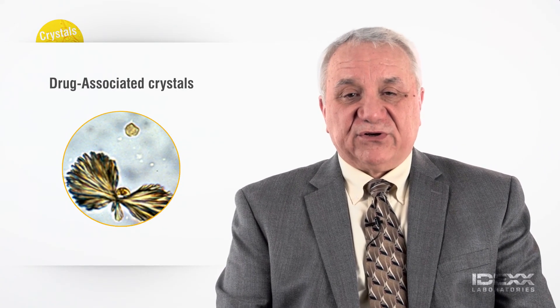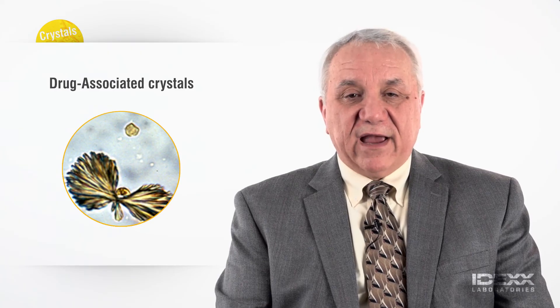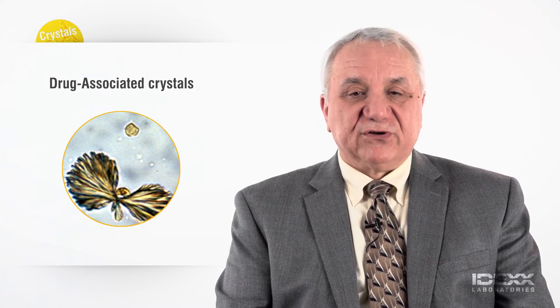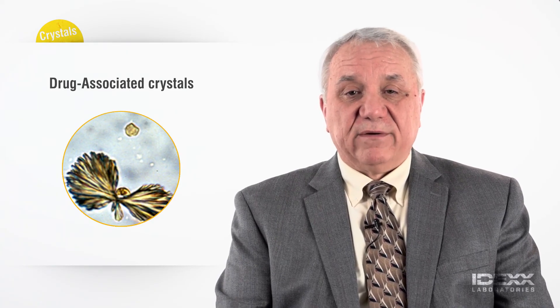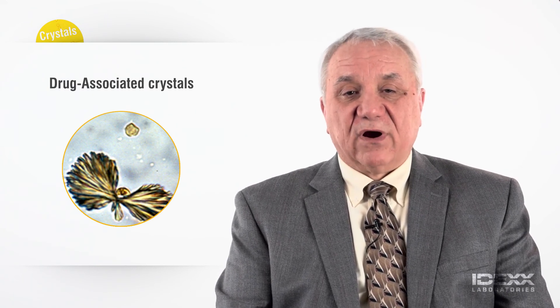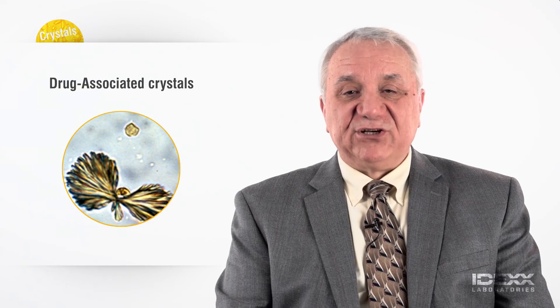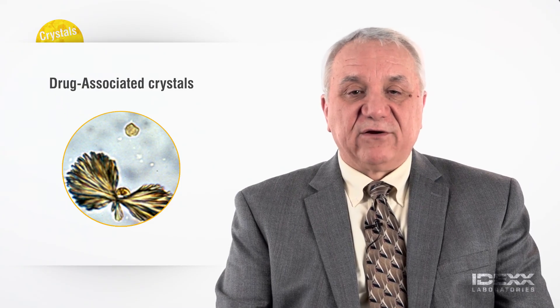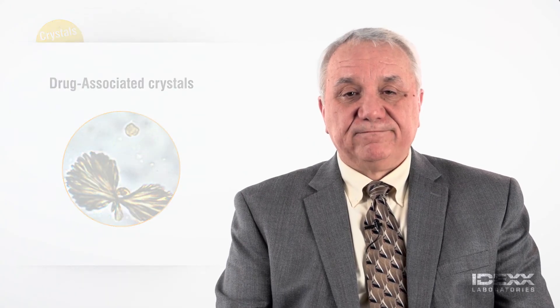A variety of drug-related crystals may be seen in the urine sediment. Whenever a crystal is identified that is not readily recognized, a drug-associated crystal should be suspected and detailed clinical historical information relative to therapy is warranted. Sulfonamide drugs are relatively definable and represent the most commonly encountered drug-associated crystalluria in dogs and cats. Sulfa crystals are often shaped like sheaves or bundles of needle-like crystals, and oftentimes these needle-like crystals will appear in a fan-shaped configuration.